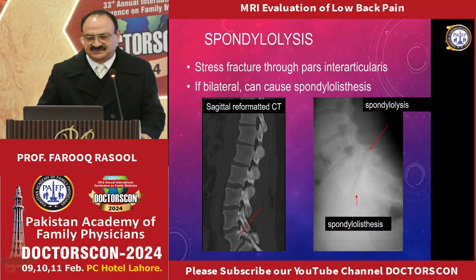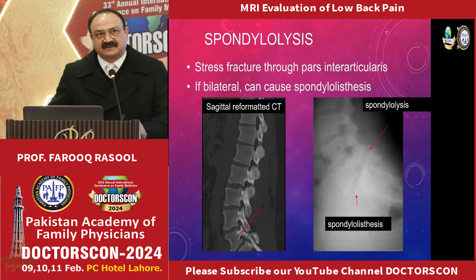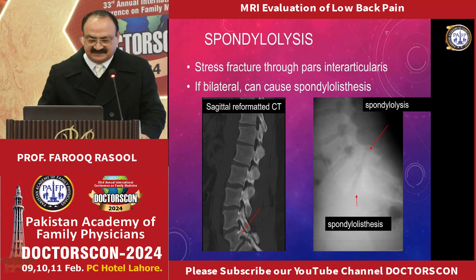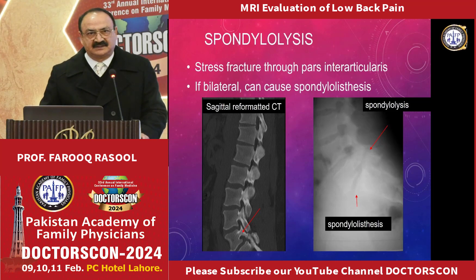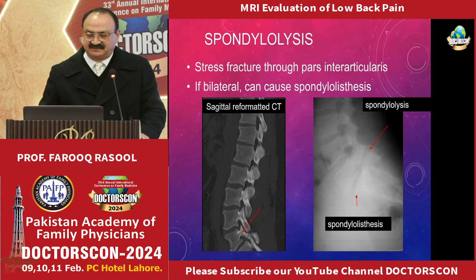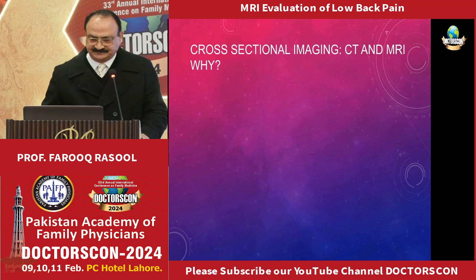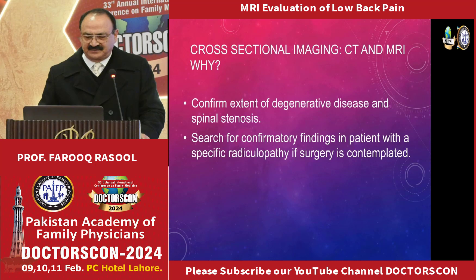Spondylolysis is a stress fracture of the pars interarticularis. It is best evaluated by MRI with T2-weighted fat-suppressed imaging, and when a fracture is present, CT can also pick it up. If there is a bilateral pars fracture, it will lead to spondylolisthesis, which may be grade 1. This image is showing grade 1 spondylolisthesis at L5-S1. Cross-sectional imaging — CT and MRI — confirm the extent of degenerative disease and spinal stenosis.